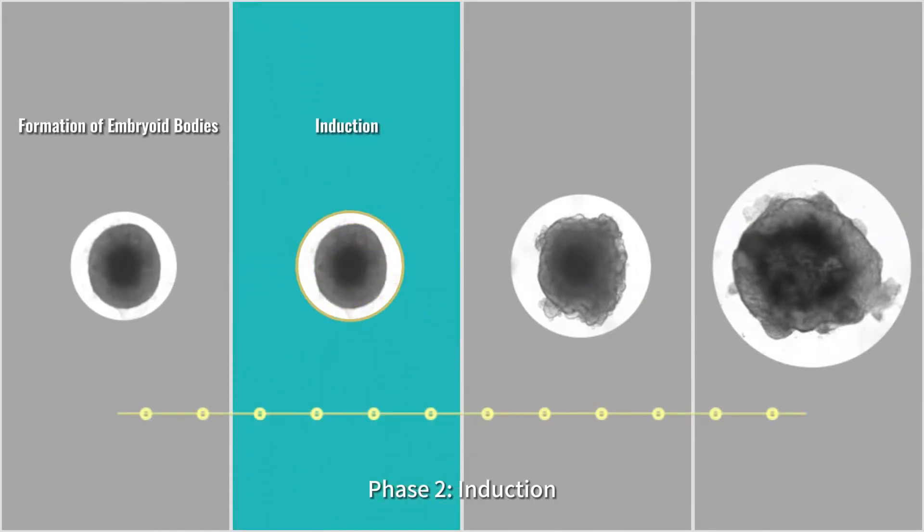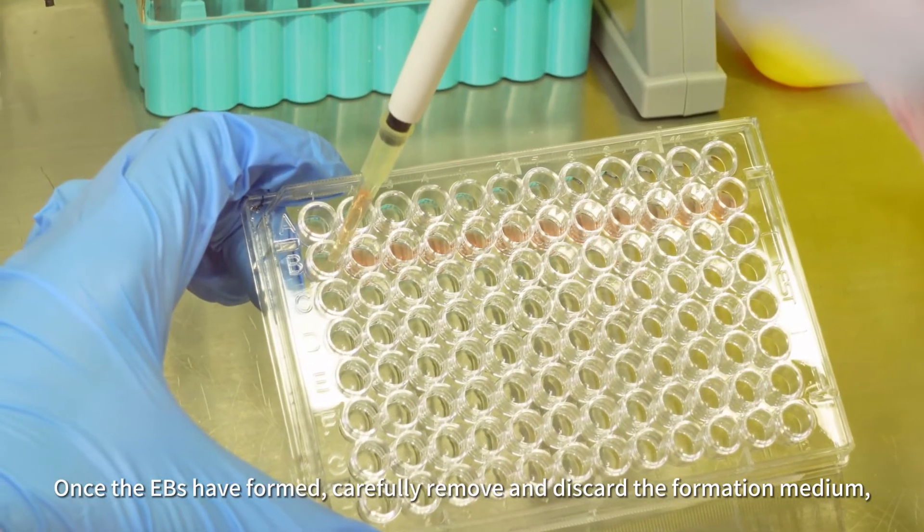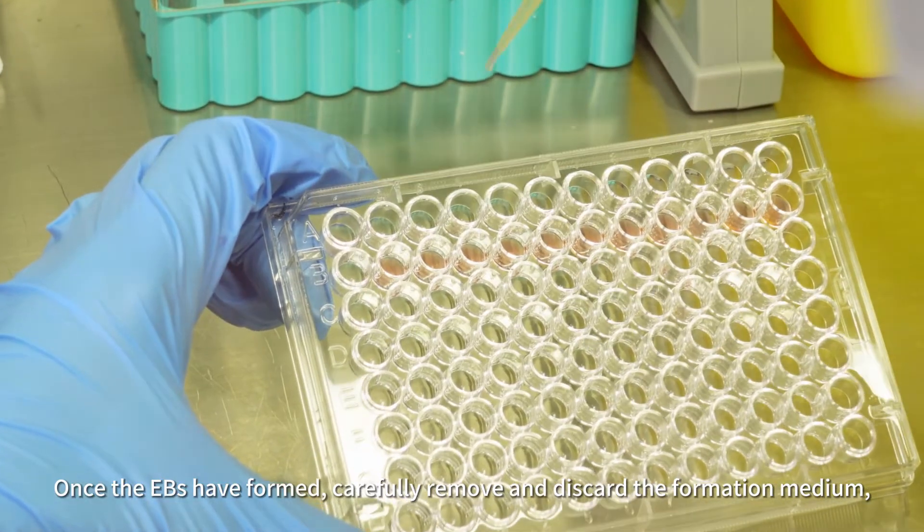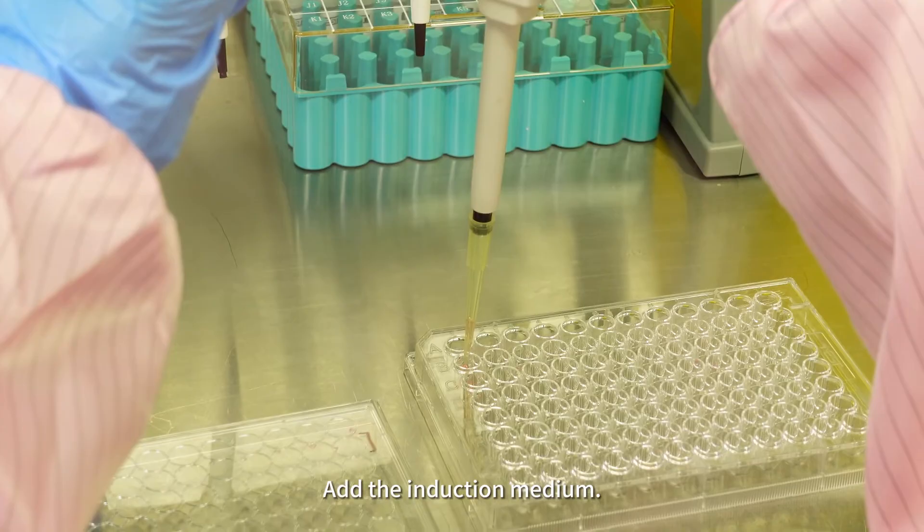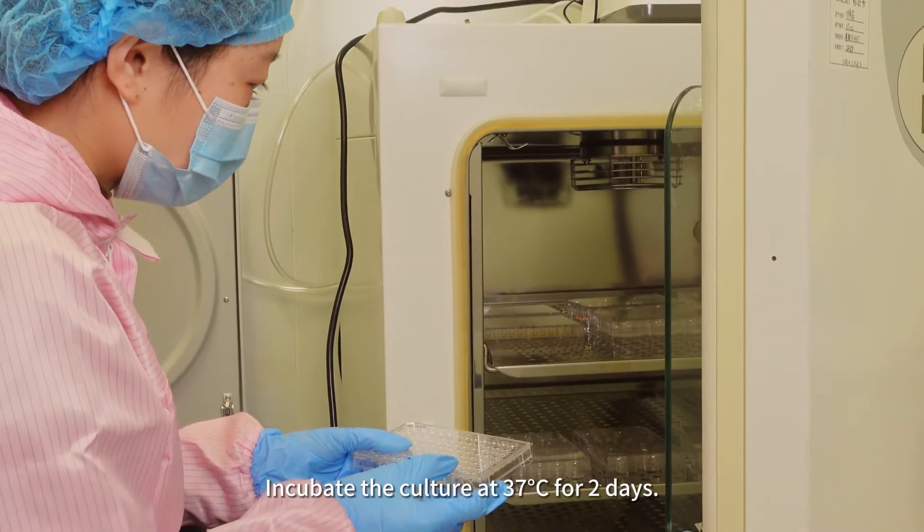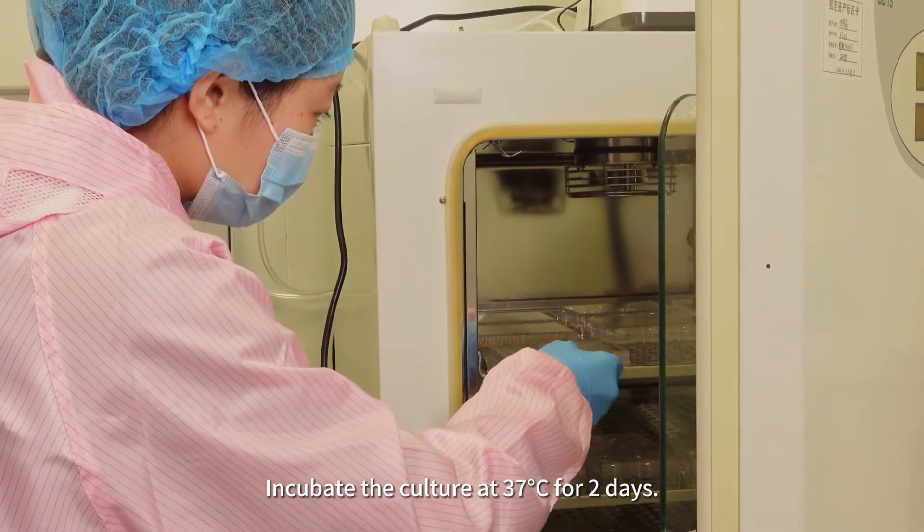Phase 2, Induction. Once the EBs have formed, carefully remove and discard the formation medium. Add the induction medium. Incubate the culture at 37 degrees Celsius for 2 days.